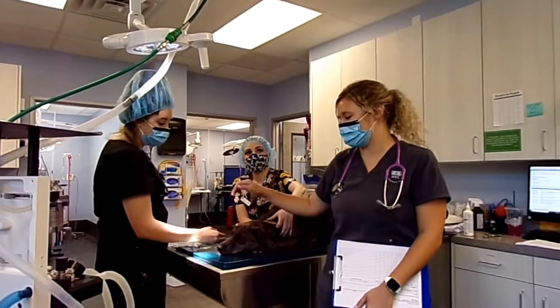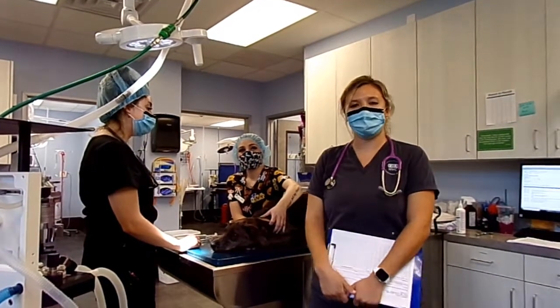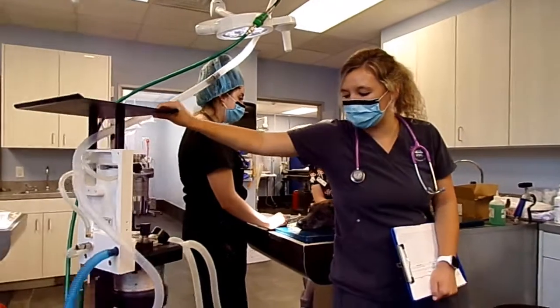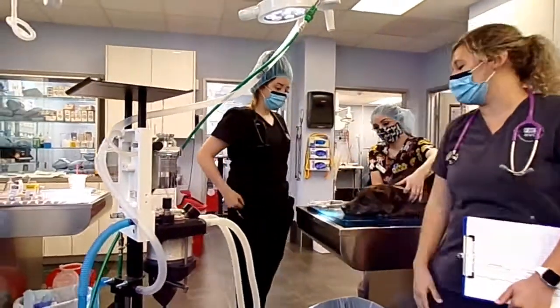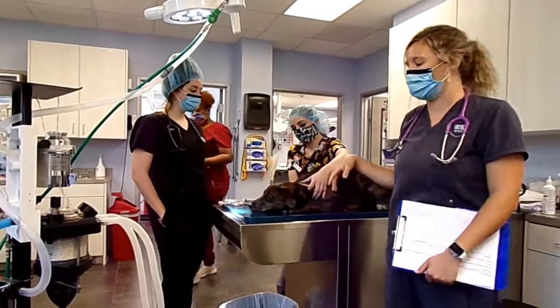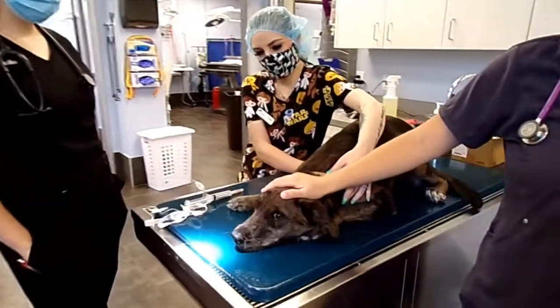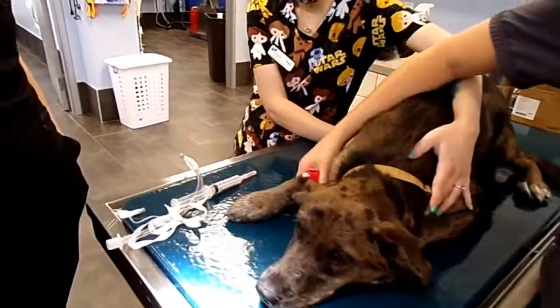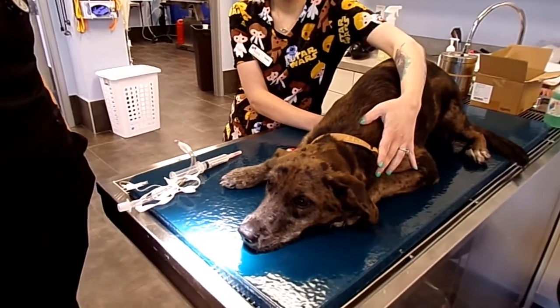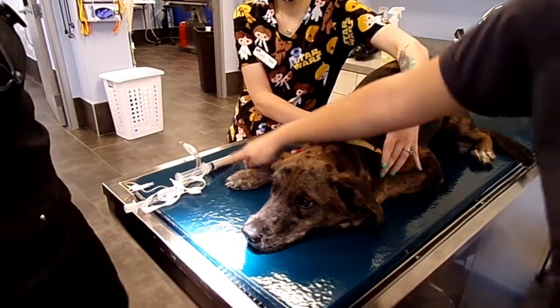This is Miss Harlow, our little seven-month-old Catahoula mix, and she's getting spayed today. We're going to talk through our induction process. We have our anesthetic machine out here ready to go. We have our ET tube and our propofol. She's already been pre-medded and we already placed a little IV catheter. Next, we're going to induce anesthesia and start pushing the propofol.